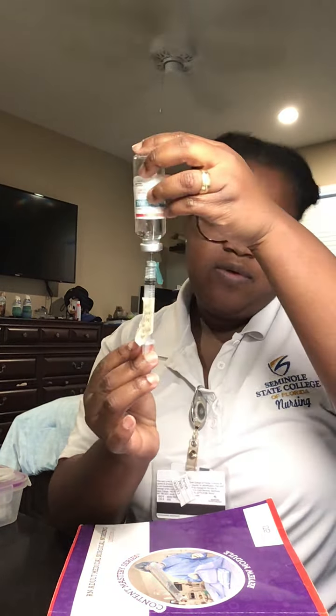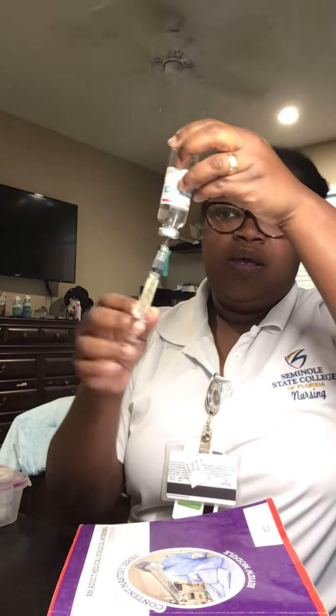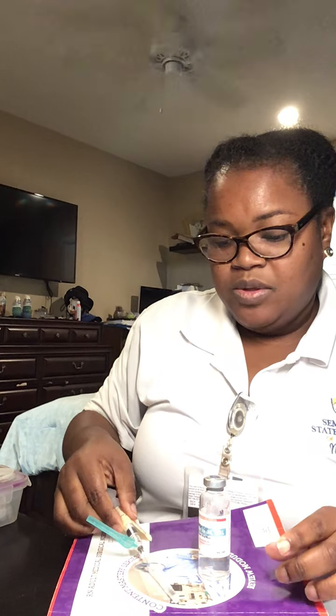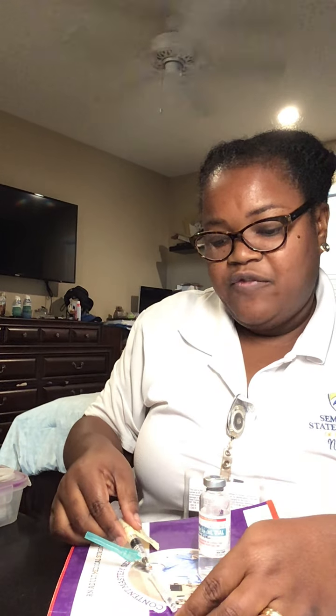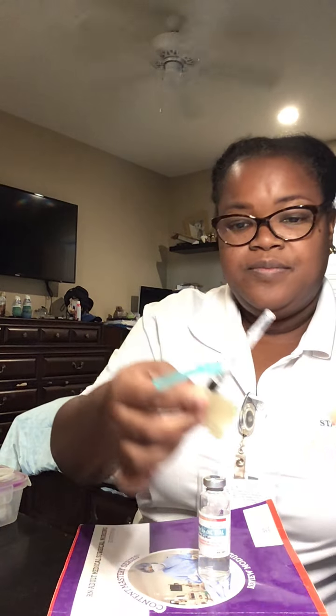If I have any bubbles, I have to just tap it, or I can return the liquid to get rid of any air inside. Okay, I switch, take it off and recap without touching, because I don't want to have any accident. Okay, this is done. That was influenza for intramuscular.